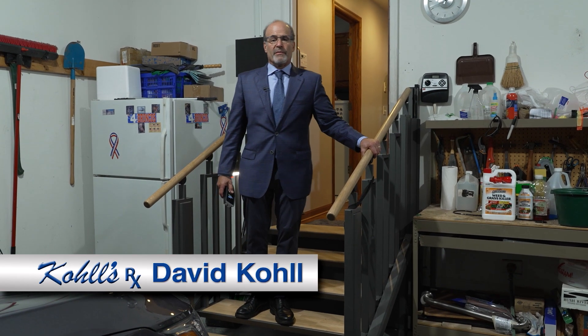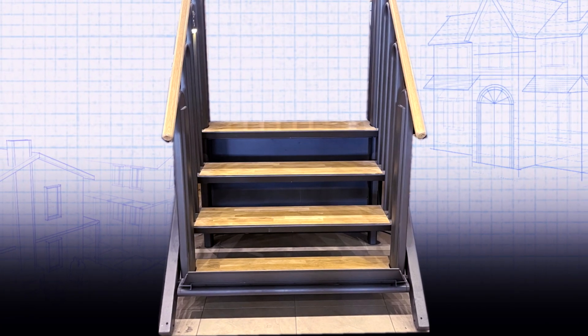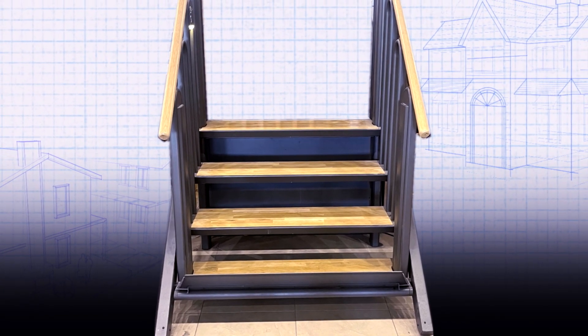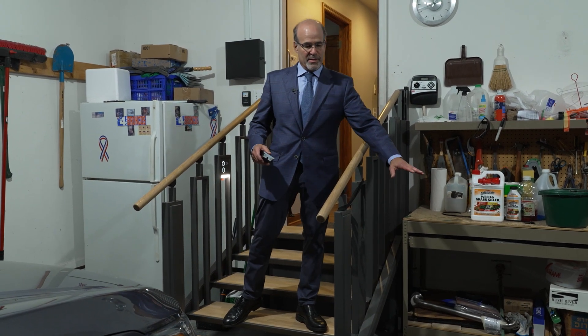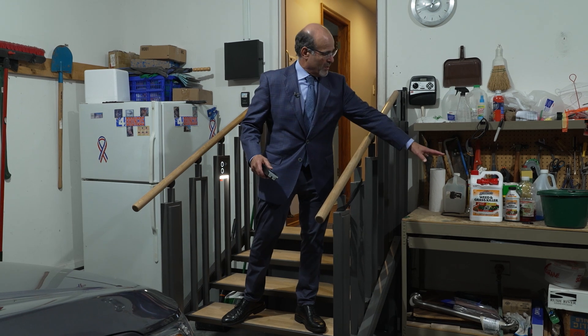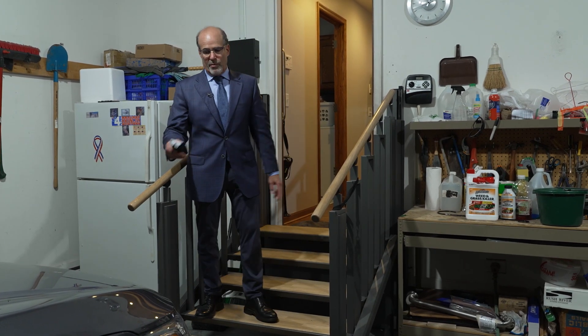This is a Flex Step. It's a phenomenal solution for space saving in the garage. Typically you build a platform here and the lift next to it, so it takes up twice as much space as what you have here. So it won't work for this, it won't work for the fridge, and it won't work for the car.